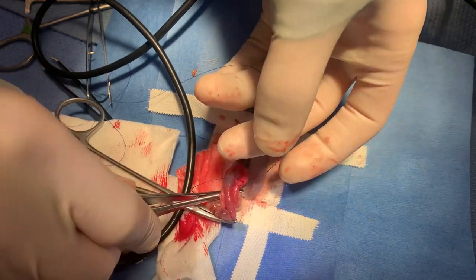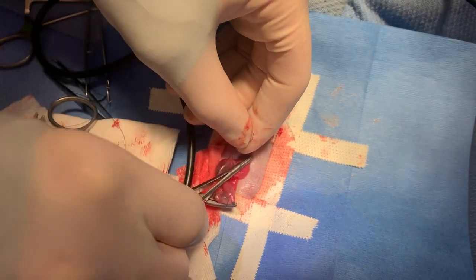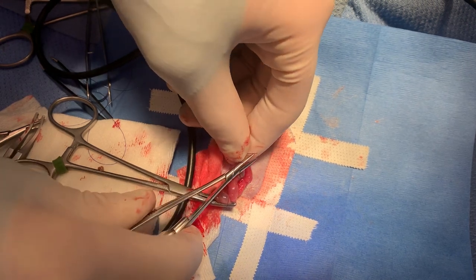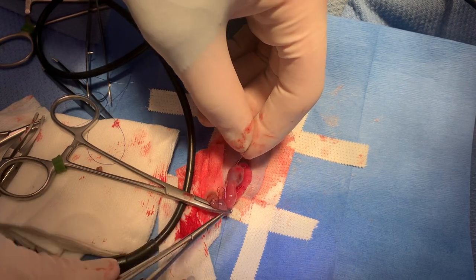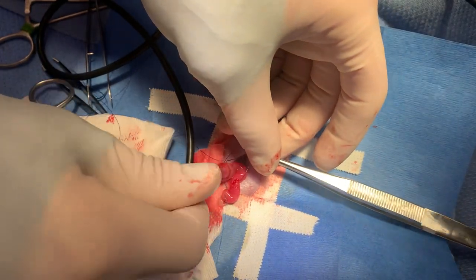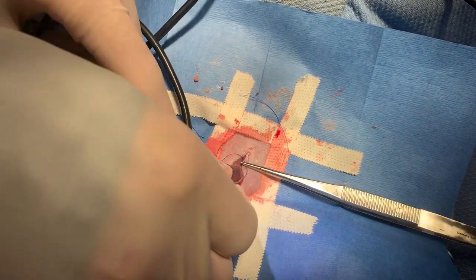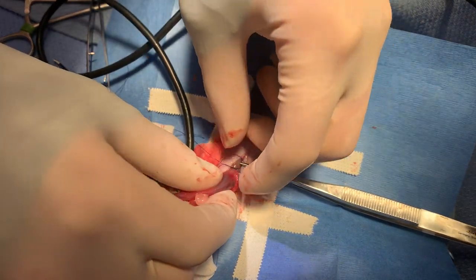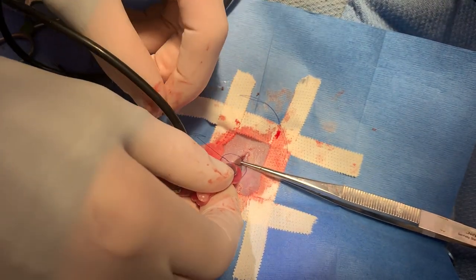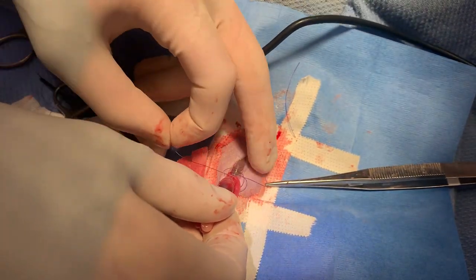It's such slow going because the tissue's so delicate. I'm trying not to be overly aggressive and tear something and have it bleed a half mil and be catastrophic. This thing's blood volume is probably 17 mils. It's usually about 10% of body weight in grams, and as far as blood draws, you can take about 1%. So you could probably take about 1.7 mils in this girl relatively safely. That's about as much as I would want to lose in surgery, and we're certainly well below that.